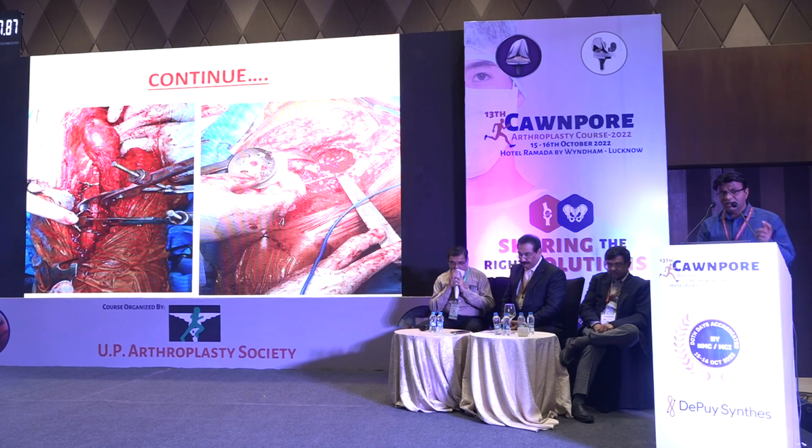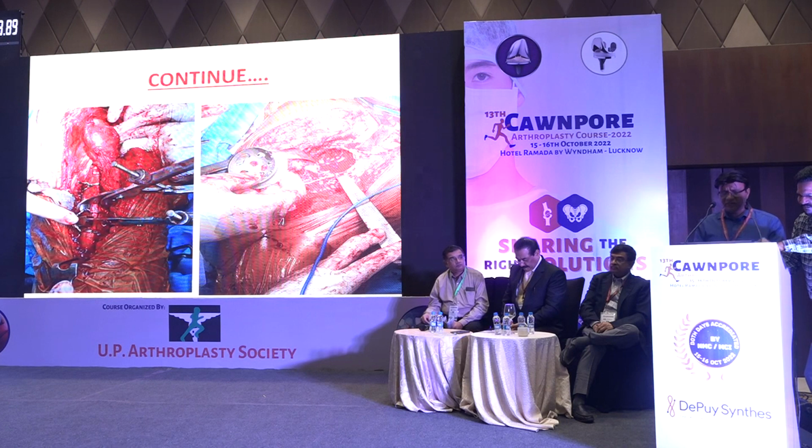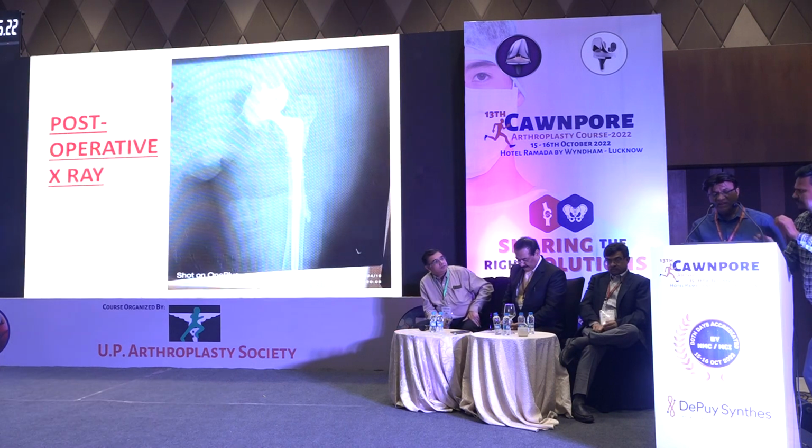And after removing all this, I put SS wires and used a clamp. In this case, I was specially ready with a fibula also. Suppose I didn't have any lateral cortex for support, I would ask my assistant to drape the fibula also. Appropriately, I didn't find any need to place the fibula in this case. This is the immediate post-operative picture.